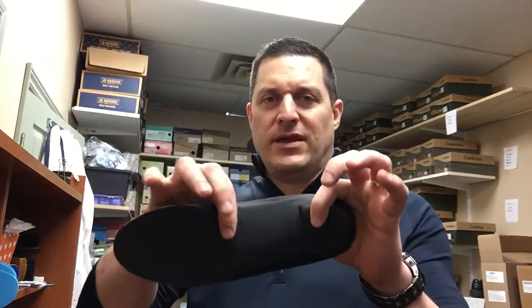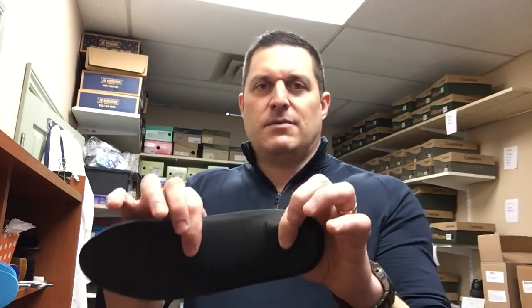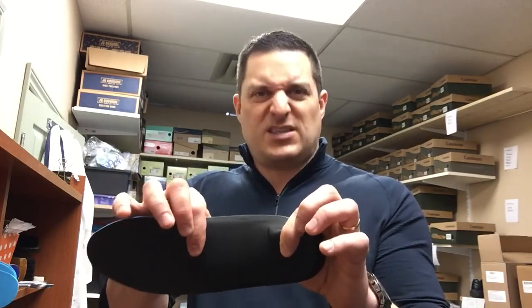So the one that I like to use, and I don't mean to endorse any particular item, there are lots of different good ones out there. But the main thing is that we want one that doesn't have a huge amount of flex in the middle there. We want something that when you stand on it, it isn't just going to collapse down on you. So this one particularly here has a pretty stiff support. It does have some flex to it. It's not like a complete rigid piece of steel, but it's fairly firm.